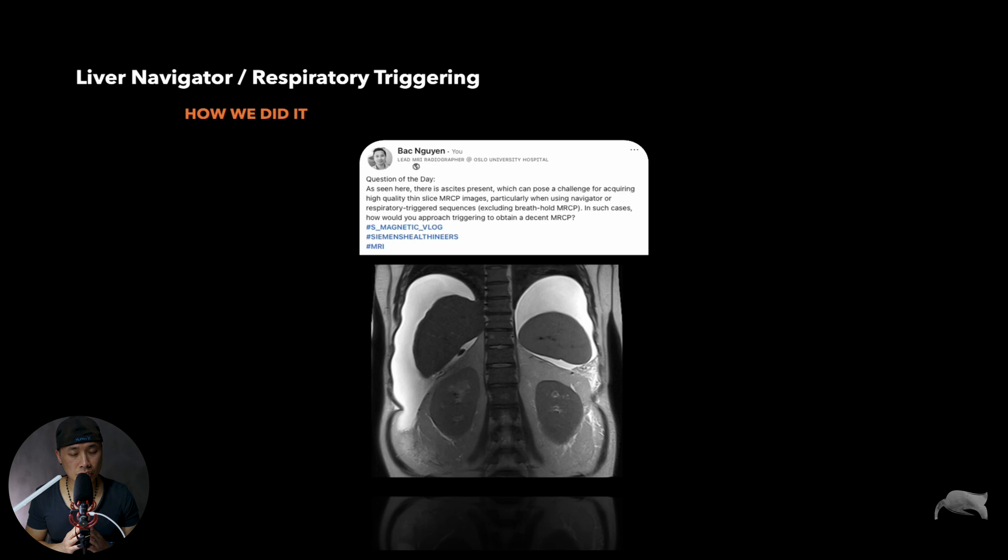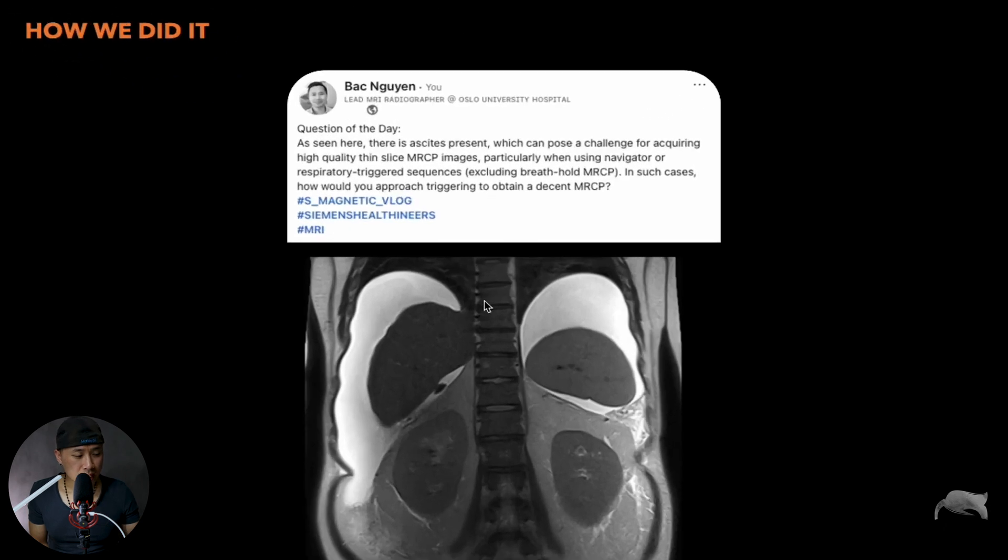The case goes like this. This was done on a 0.5T Siemens scanner. As you can see, there's a lot of ascites here. The question was: how do you manage to do the navigator or respiratory triggering for the MRCP — the thin slabs of the bile duct system? We know it's always challenging when you have ascites like this. So when and where should we put the navigator or respiratory triggering?